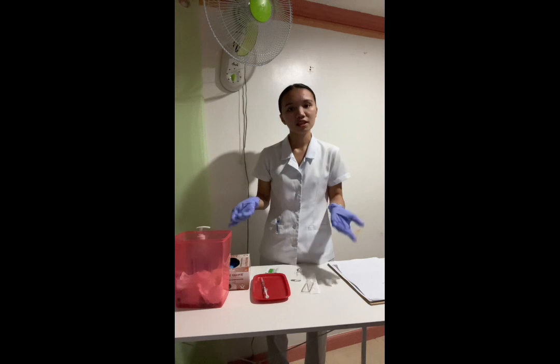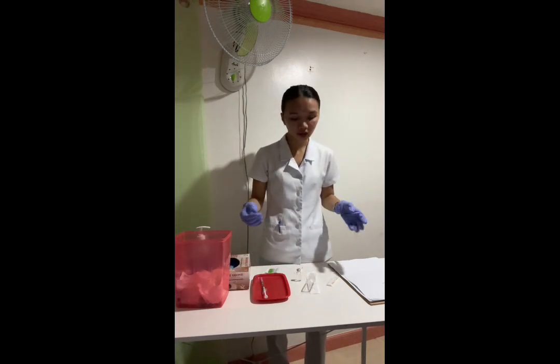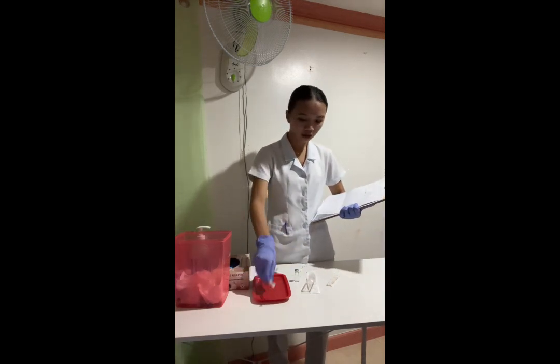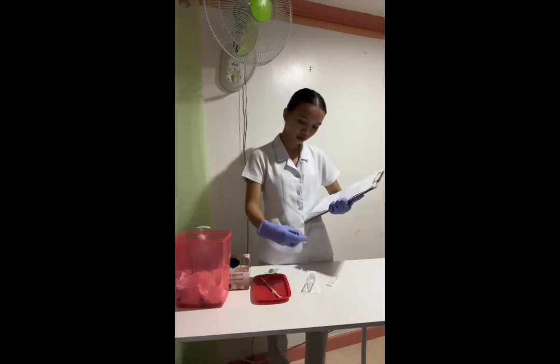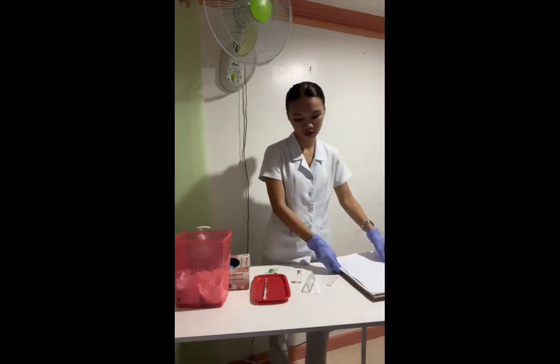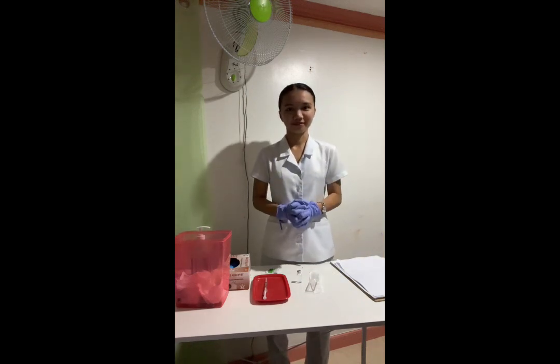Since we have withdrawn the medication from the vial, we are going to check it again against the MAR to ensure that we have the right dose and the right drug. Since the name is in here, and we have also gotten the right dosage of the medication, now we can go to the patient's room.